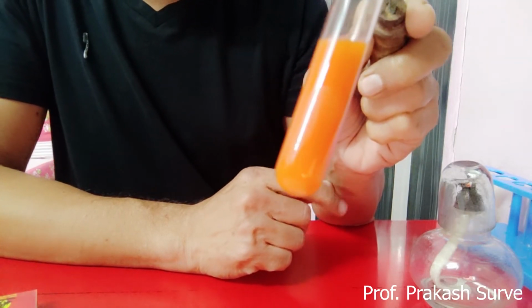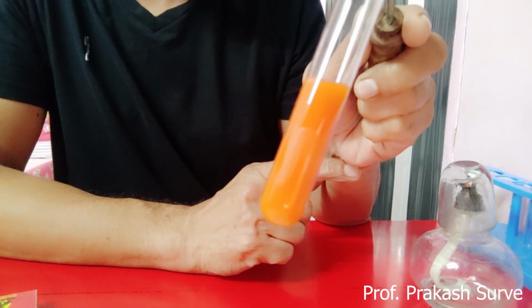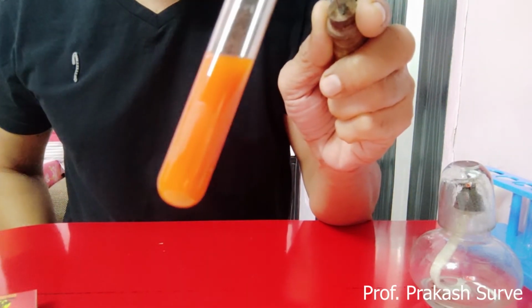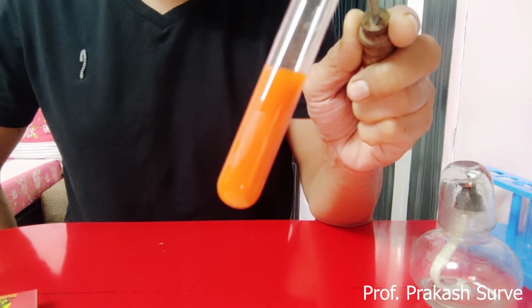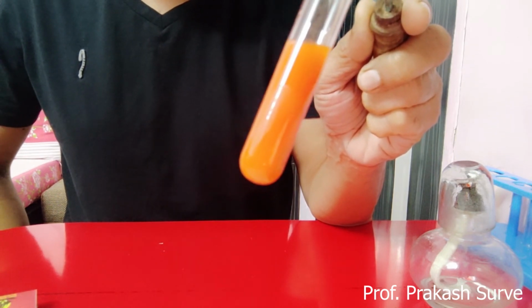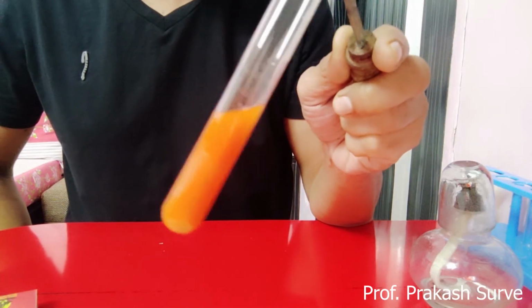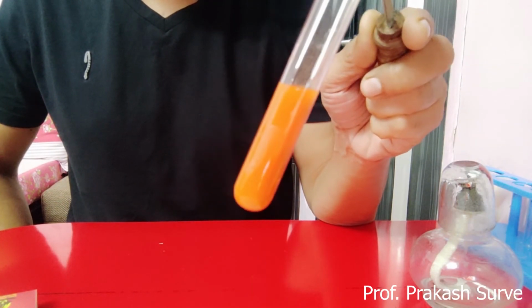So sugar present in the urine sample, the glucose reduces the alkaline CuSO4. The glucose in this urine sample reduces the alkaline CuSO4 present in the Benedict reagent, what we added in this. So this Benedict reagent gives cuprous oxide, giving the brick red precipitate. So here we get the orange red to brick red color precipitate.